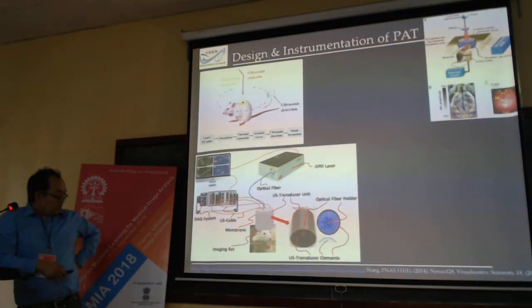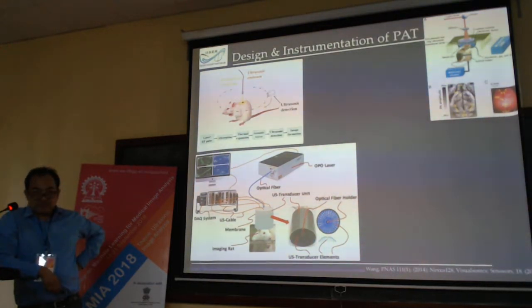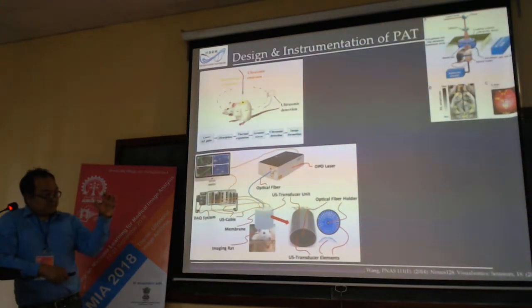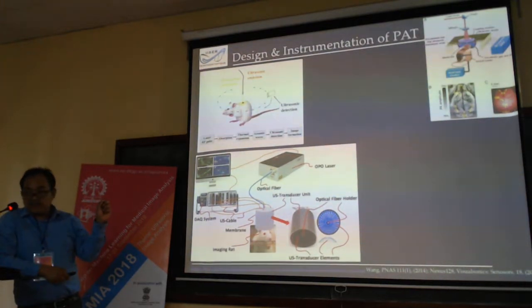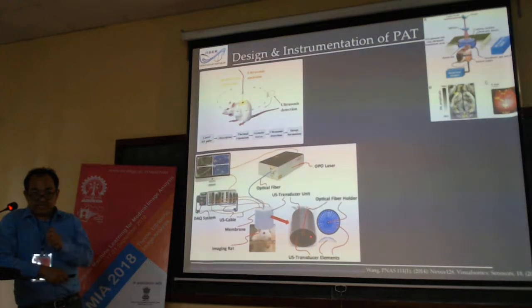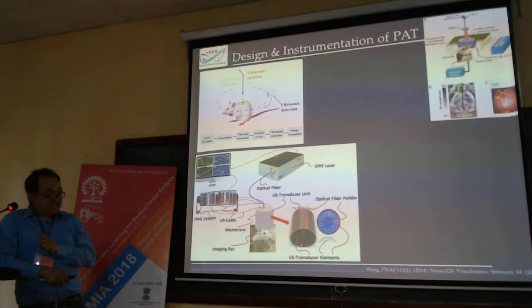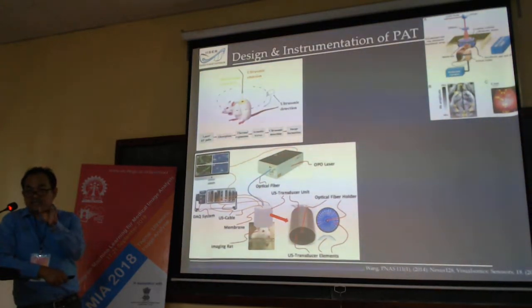How it is done is that it is a curved transducer with 512 elements. The axis of the element, in the sense of the imaginary line passing through the center of this element normal to the surface, intersects at the center of an imaginary spherical surface, such that over the center region it is highly resolving of the sample.